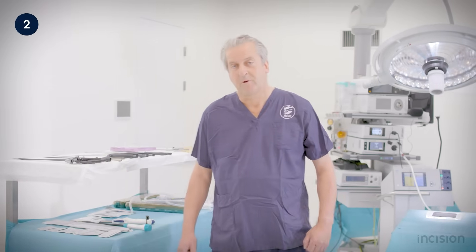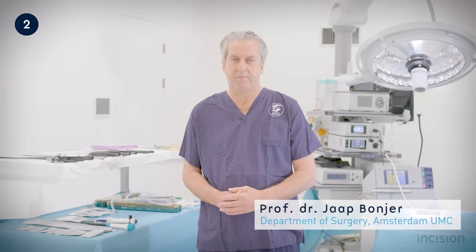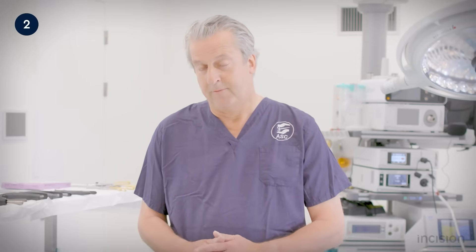Good morning. We're going to perform laparoscopic surgery today and I want to share with you some essential steps that you need to take before you start the case. First of all, discuss with your team which procedure you are going to do, what kind of trouble you may expect, and which instruments and which supplies you need. I'm very particular about all the instruments and all the supplies, and what I often do is go with the OR tech to the supplies room and make sure that we get the right stuff.